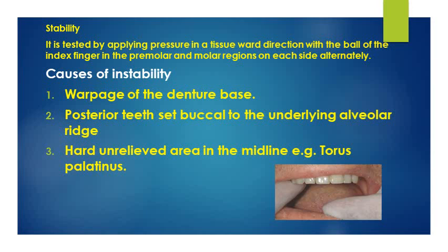Another cause: a hard unrelieved area in the midline. Okay? In the case of an upper denture, the midline raphe should be relieved. If it's not relieved, it will act as a fulcrum. So when you press on one side, it will move from the other side.